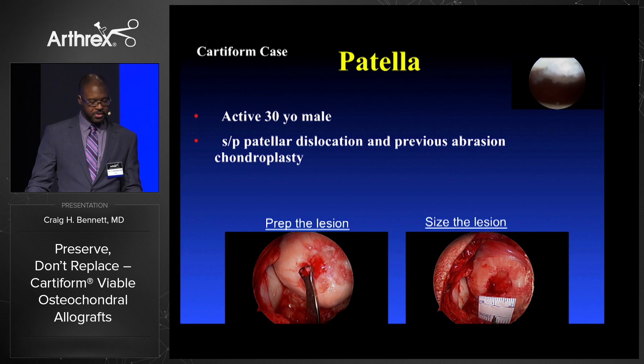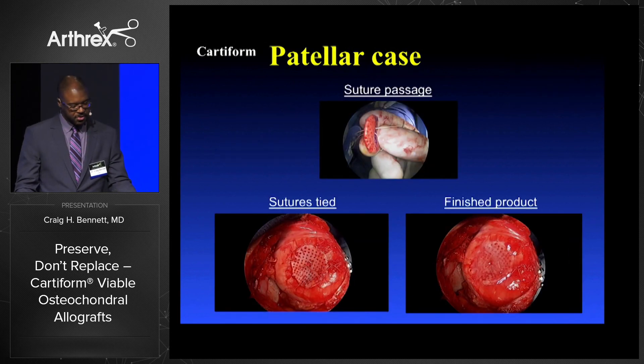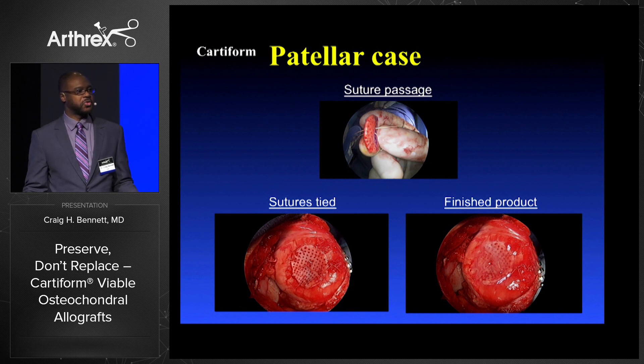Patella — a 30-year-old status post patella dislocation, previous abrasion chondroplasty. Lower left preparing the lesion, lower right sizing the lesion, sutures are placed, the graft is tied. This is one where the sutures are outside, and again I've seen no difference when you put the sutures on the outside versus when you bury the sutures under the graft.